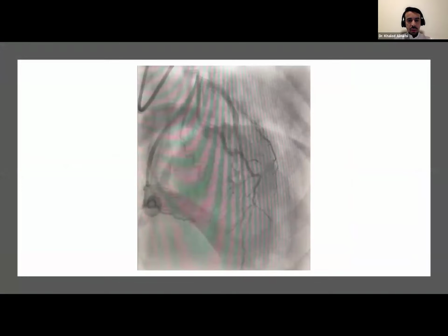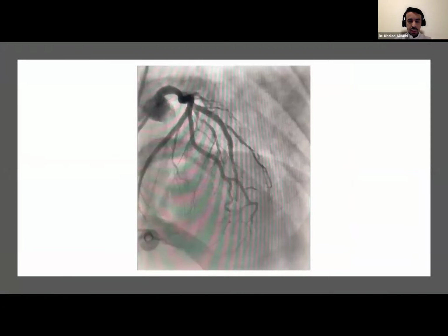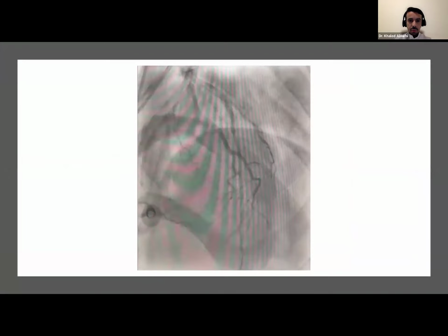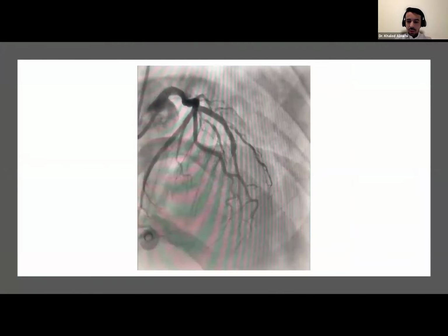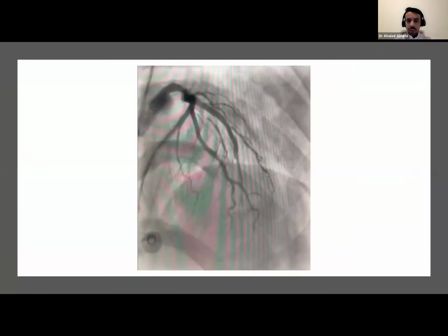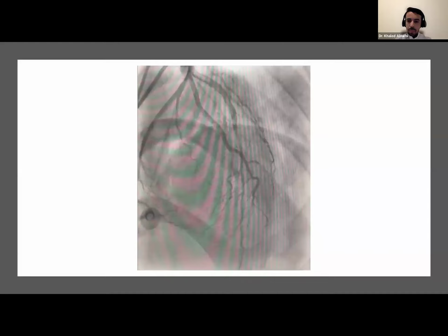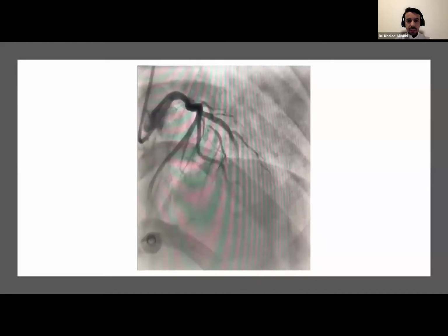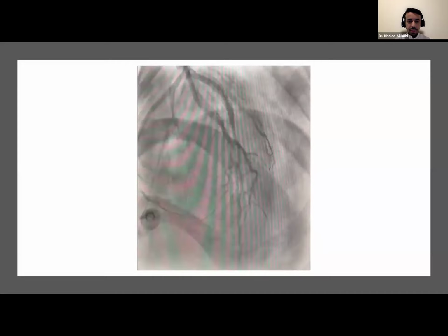We used a long stent, I think 44. We post-dilated from distal to proximal, and also confirmed there is no pre- or post-stent dissection, and we left the distal lesion for medical therapy.